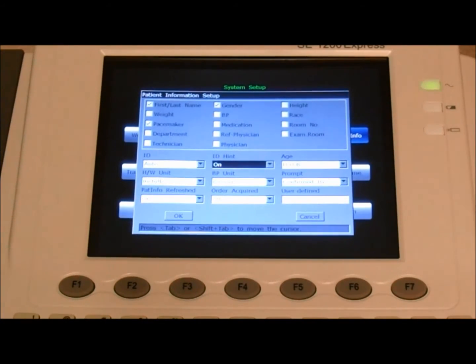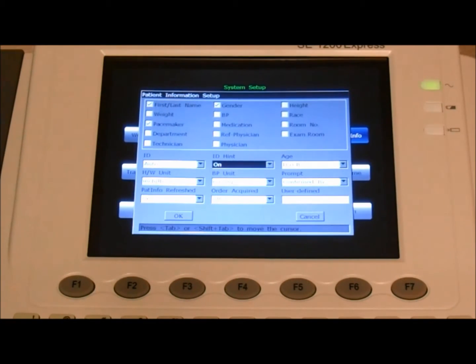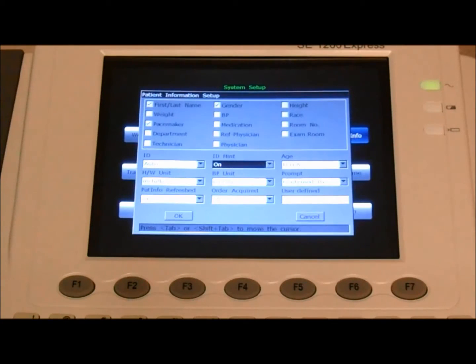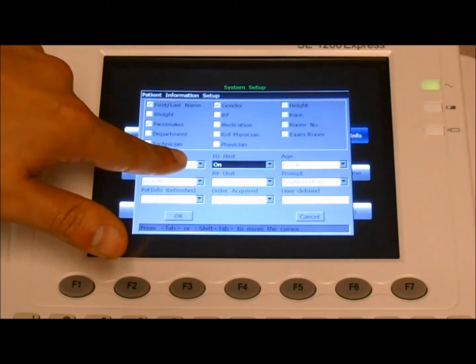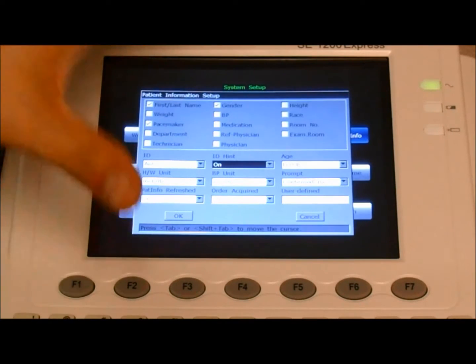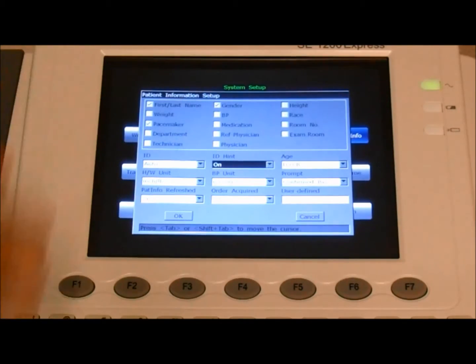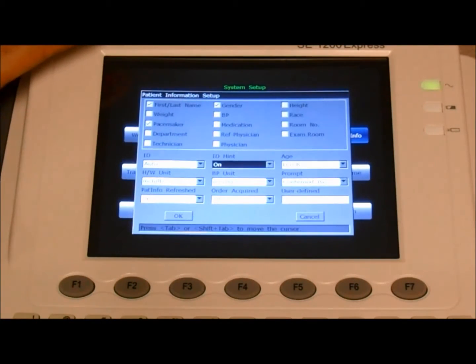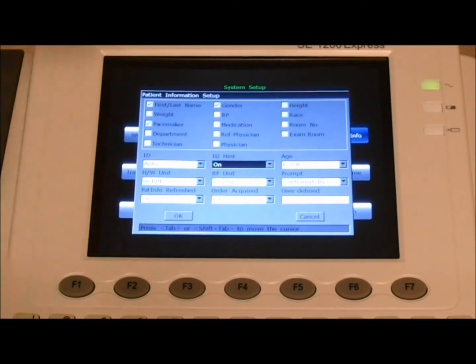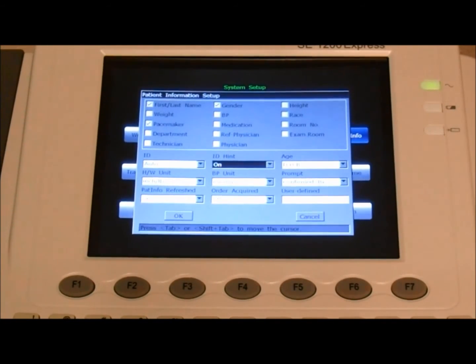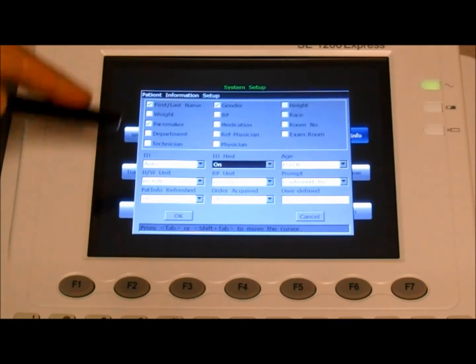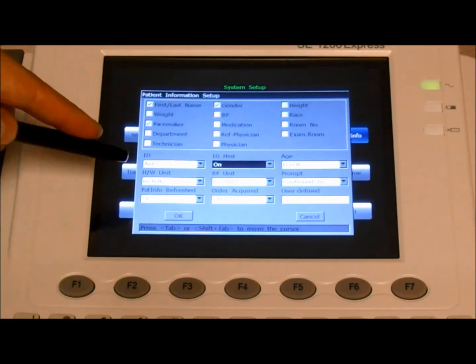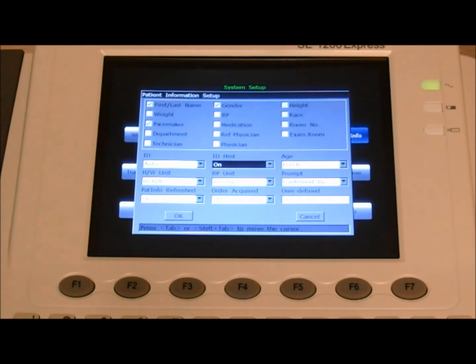Next, we have the ID hint. If it's set to on, when you have a new patient, before being able to print or generate the report, if you have your ID hint to on, the system will remind you to enter the patient information prior to being able to execute the exam. So if you want to make sure that you're entering the patient's name every single time, you want to leave it as on, because if you don't, the system will remind you.